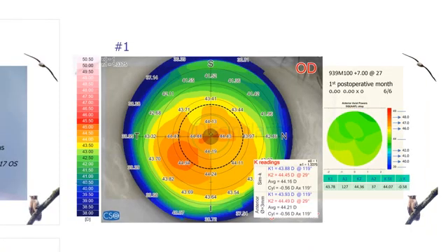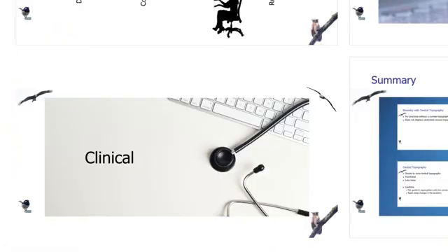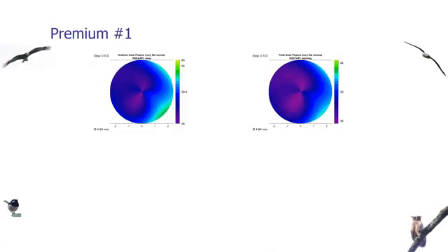Next we'll see some clinical cases. This patient was being considered for premium IOL. This is a very flat cornea, typical of post-myopic laser cornea. I generally don't put multifocals in patients who've had laser refractive surgery done, especially if pre-LASIK they had high myopia or high hyperopia. It's up to your confidence level.